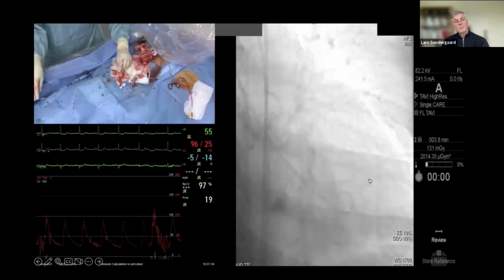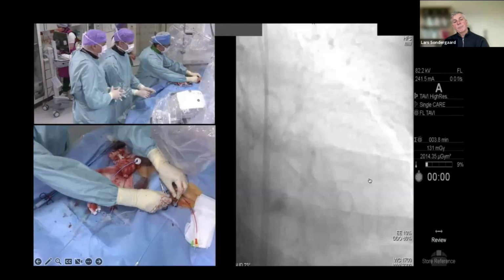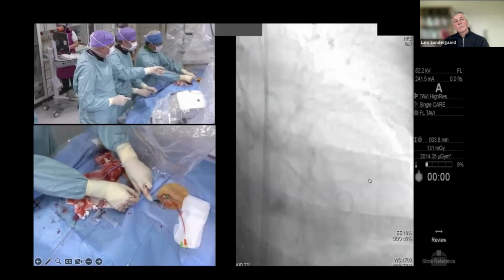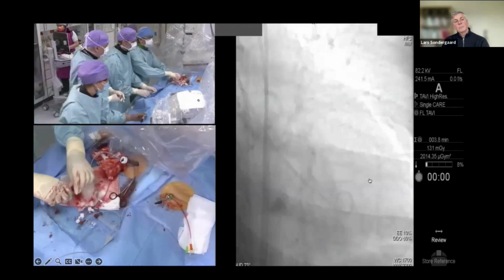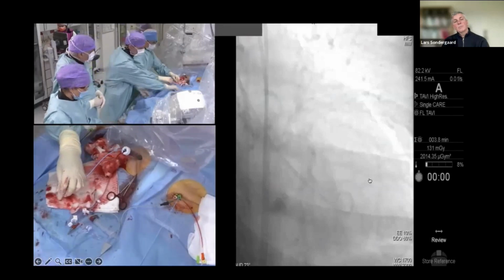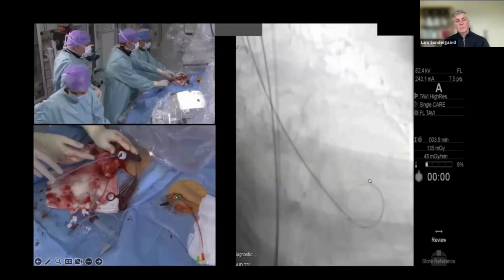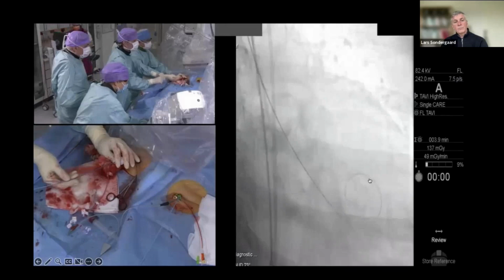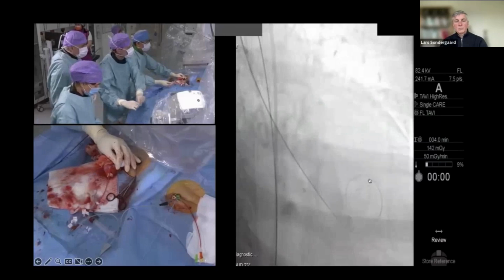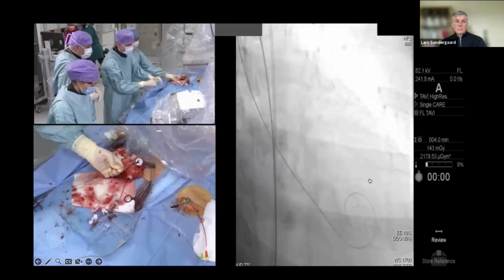So we can bring in a small wire already, maybe. Yeah. Once again, we're going to do LV pacing. Gintas is connecting one of the crocodile connections to the short guide wire sitting in a short venous sheath, and the other crocodile attachment is going to go on a stiff wire in a minute. We're going to use our default guide wire, which is a Safari guide wire from Boston Scientific, a pre-shaped wire giving good support. I think that's the default stiff guide wire, not only in this institution but in most institutions in Europe. I know in the US there's a trend to use the double-curved Lunderquist guide wire, but I think this wire works fine for us.